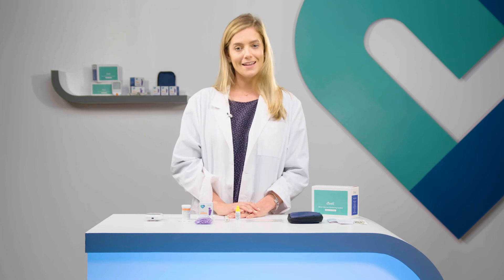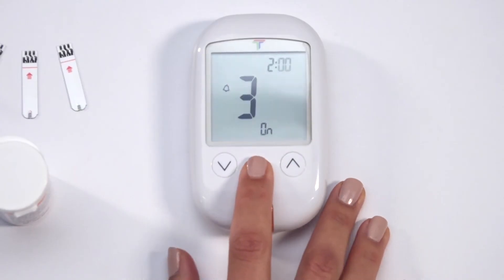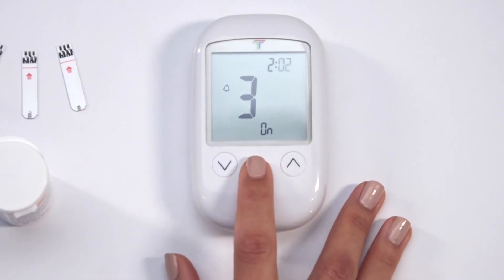If off is selected, the meter will proceed to the next reminder alarm setting. There are up to four in total. If you select on, you must then select the hour and then the minutes of the desired alert using the arrows to scroll, confirming with the M button for each. Repeat this process for the rest of the reminder alarms.